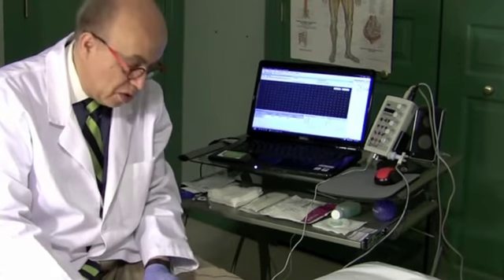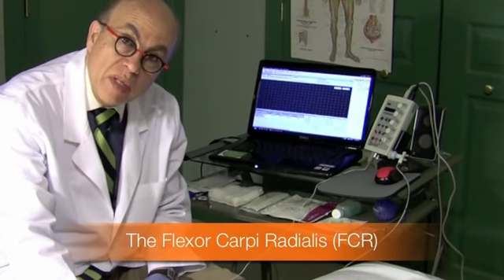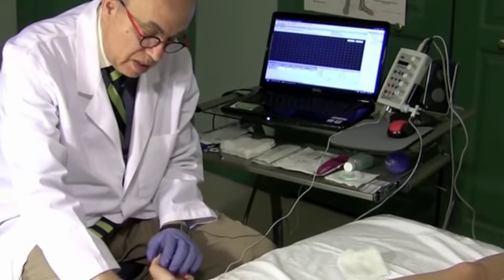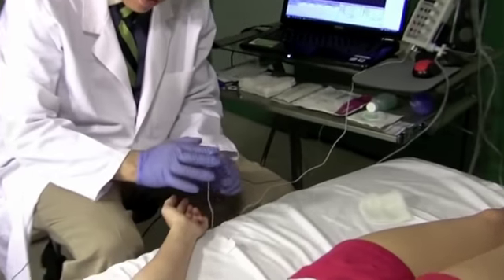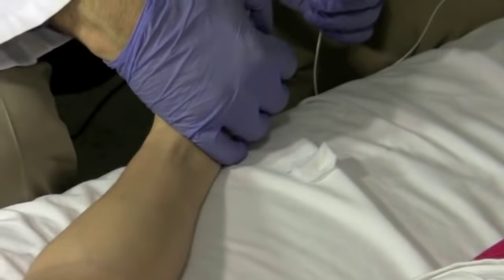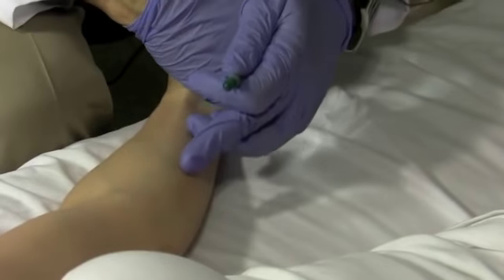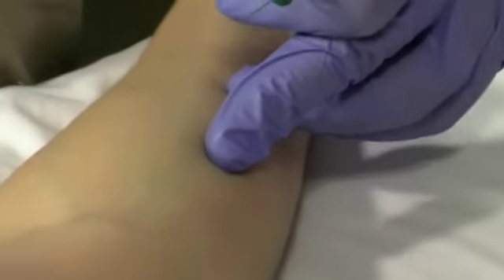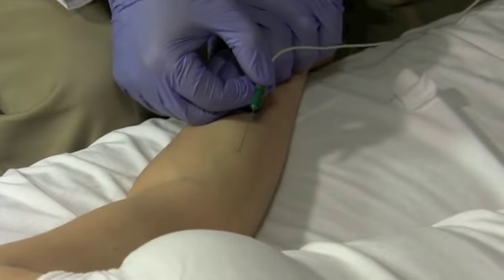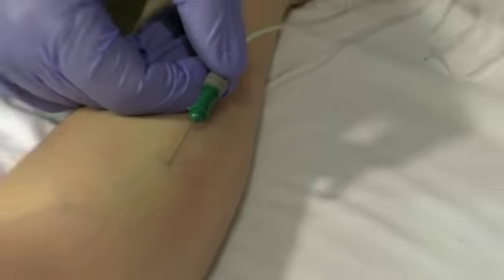So that was the first dorsal interosseous muscle. Now we're going to do the flexor carpi radialis muscle. Again, as I said, the flexor carpi radialis muscle is a median innervated muscle, and it's right here. The way I activate it, I ask the subject to pull their arm up all the way and bend your wrist towards you, and the muscle bumps up like here. Okay, now relax, and then I put the needle inside here. 1, 2, 3, that's it, and I activate it.